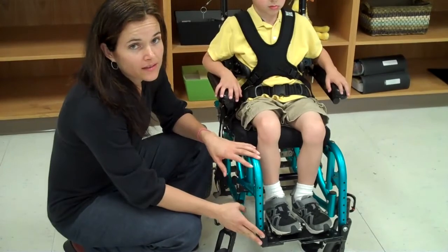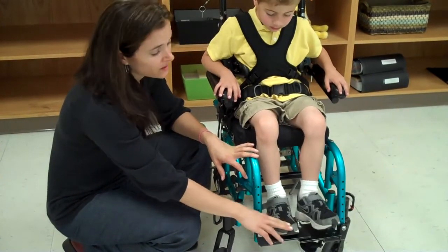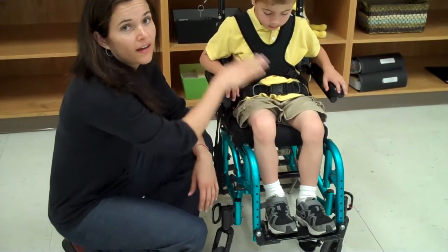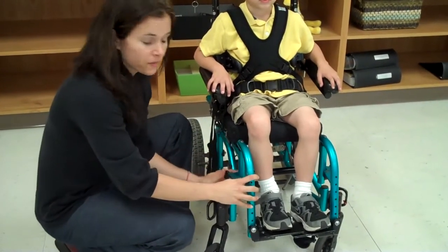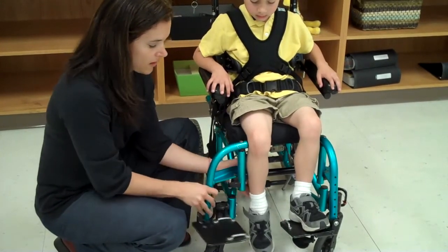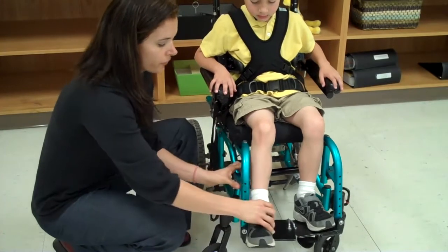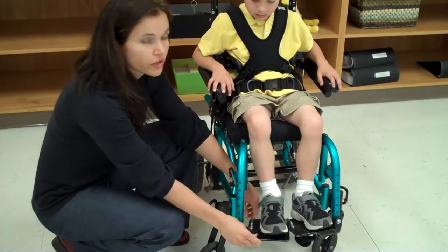These are the footrests. The footrests give the student some support at their feet. This in turn will help with positioning at their hips and their body. The footrest can be flipped out of the way to help with transfers. You may also notice some footrests will have components that help keep the child's foot secured to the foot plate.